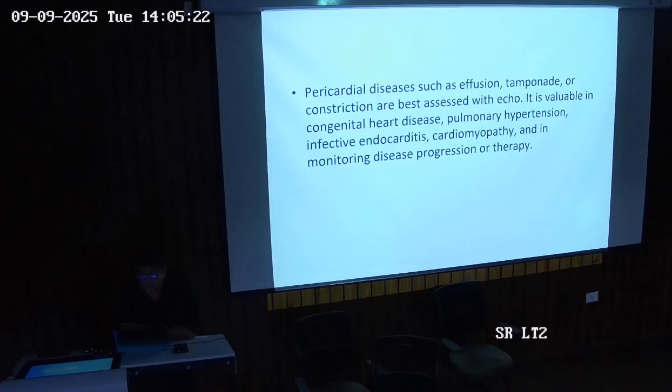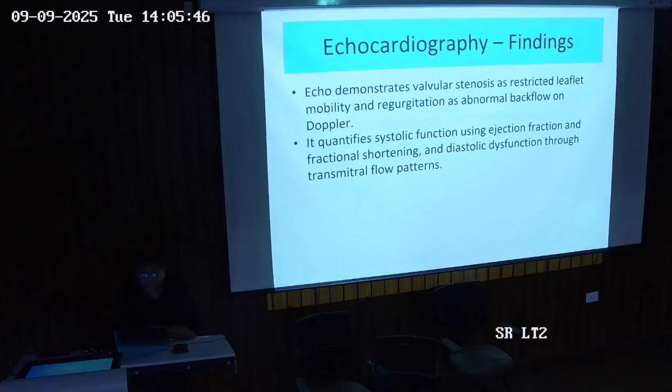In cardiomyopathy, obviously the left ventricular systolic function is assessed by the echo. So cardiomyopathy, heart failure, pulmonary hypertension, congenital heart disease, valvular heart disease, all these can be assessed by the echo, and we can monitor with the echo, and therapeutic intervention can be carried out with the help of echo.